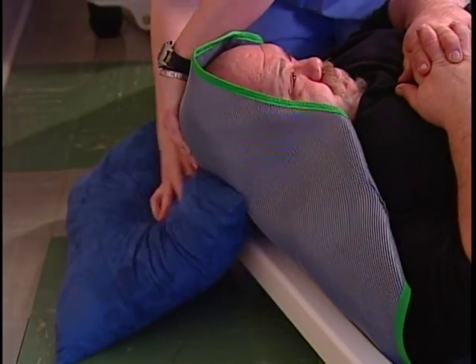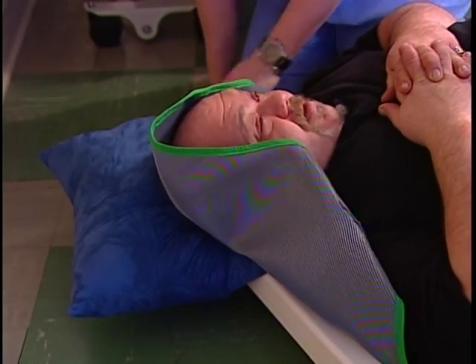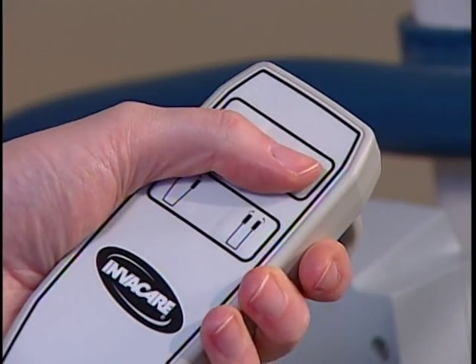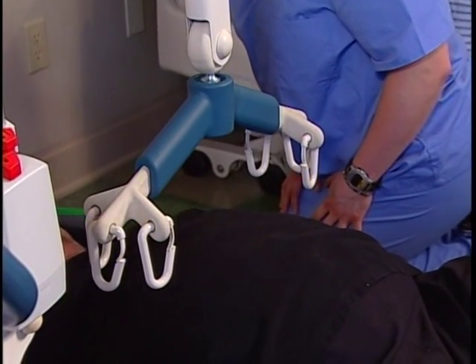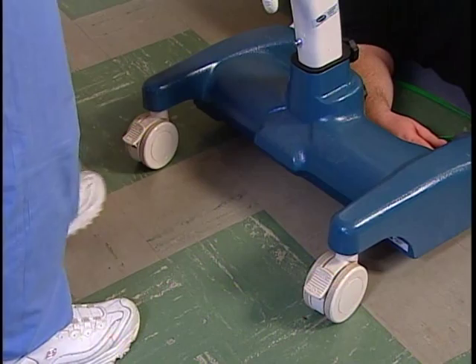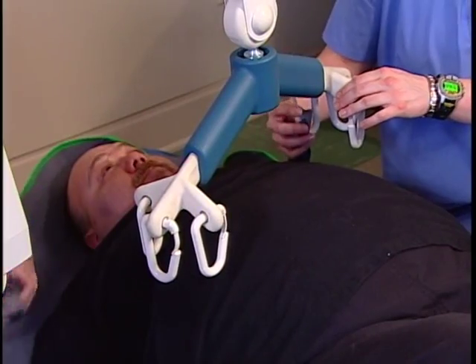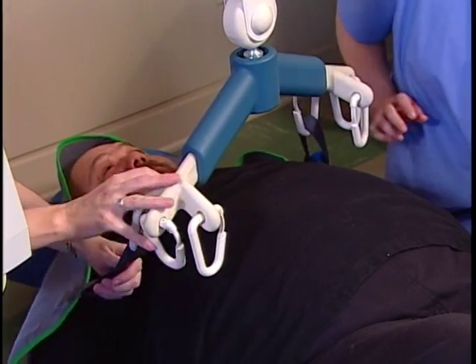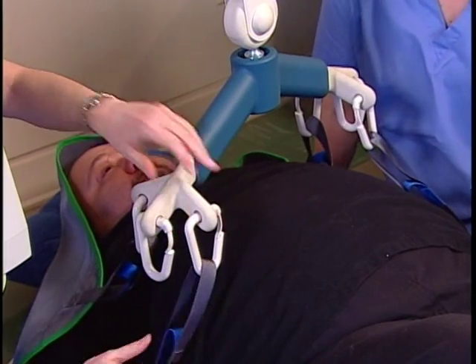Once in position, use a pillow to cushion the resident's head against the leg. Yes, thank you. Press the down arrow on the hand pendant to lower the boom arm. Center it directly above the resident to attach the sling. Lock the rear casters to secure the lift. Secure the straps to the swivel bar and make sure that the resident's arms are inside the sling.